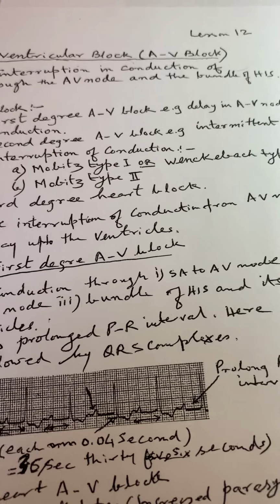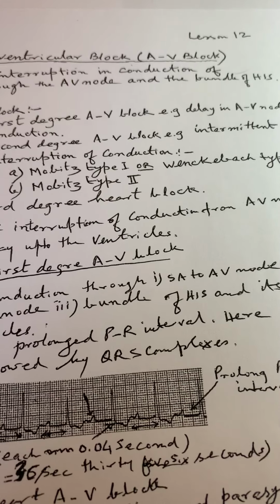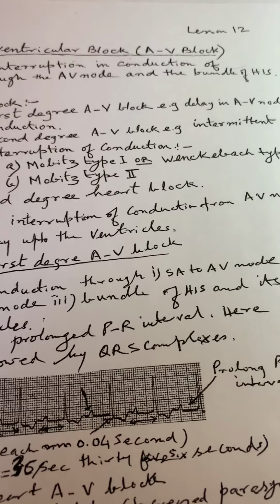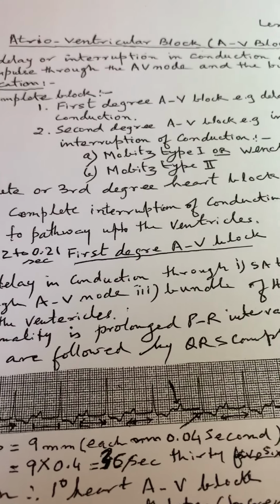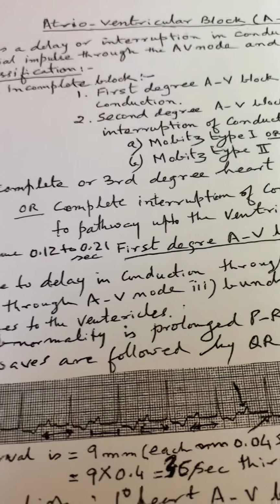This is our 12th lesson. In the previous lesson we discussed the SA block. Today we will discuss AV block, that is atrioventricular block. Now what is this AV block?